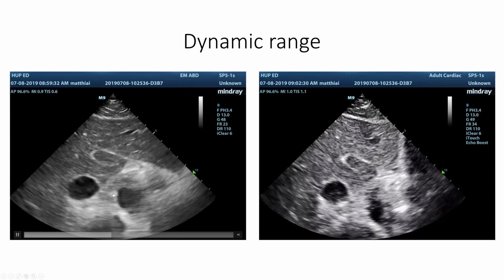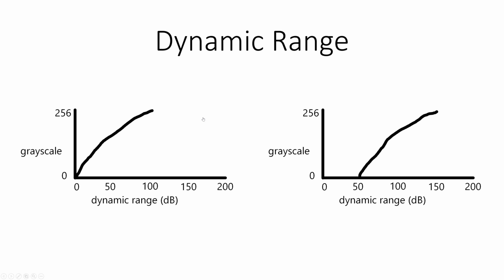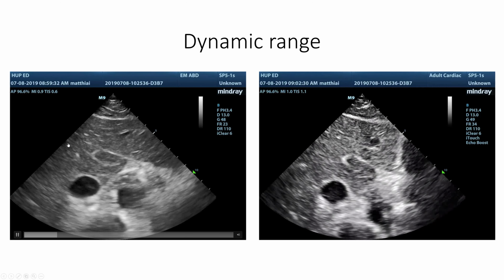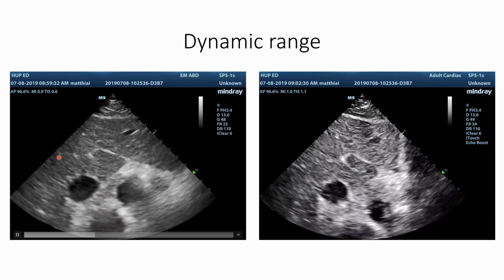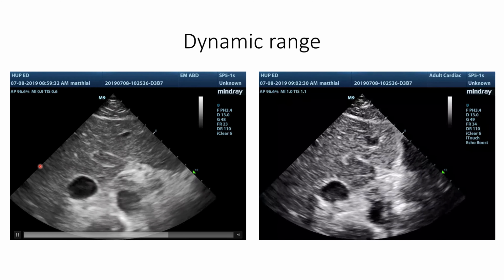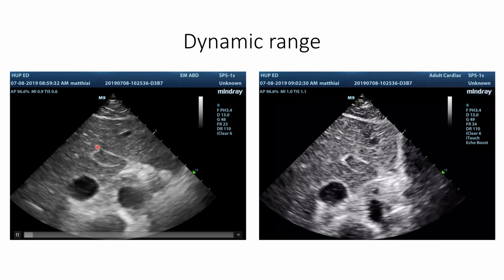So here we have an abdominal preset where the curve is more along the lines of the one on the screen left here. The lower intensity echoes are prioritized. And we see a nice looking liver with a really detailed parenchyma that I can make a comment about. No cirrhosis here, no increased heterogeneous echo texture.